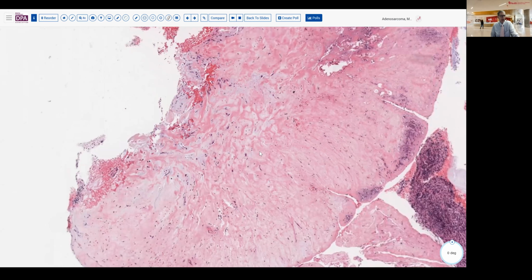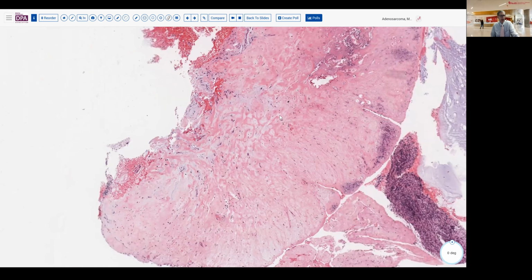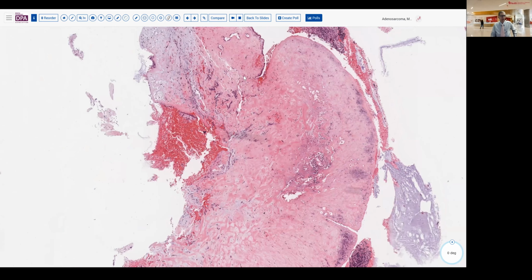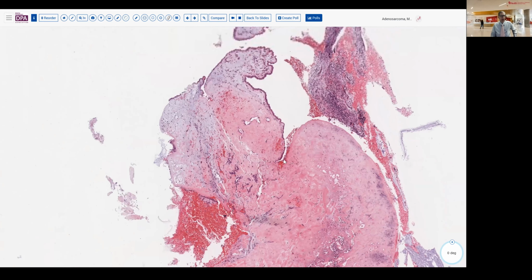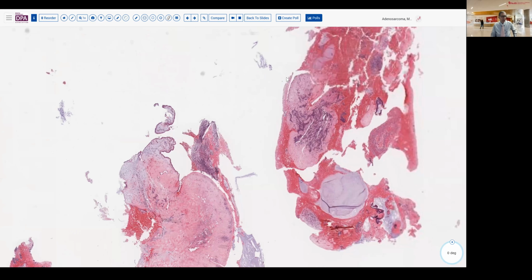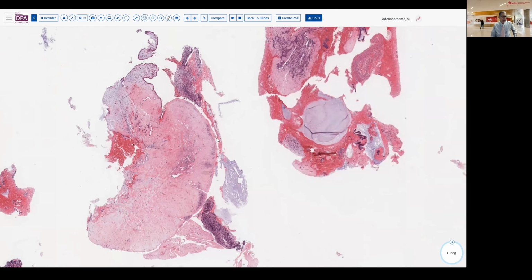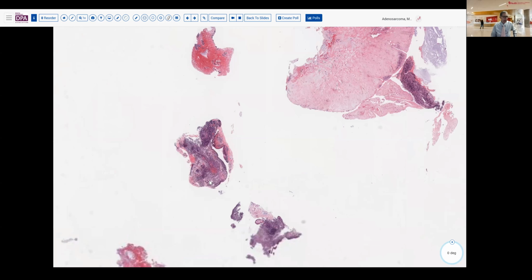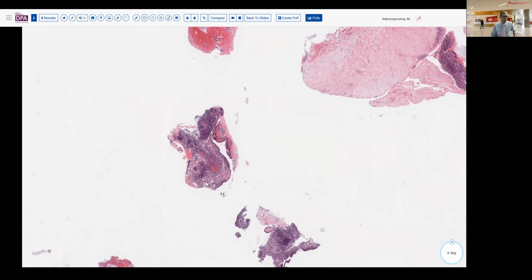So this is fairly characteristically seen in endometrial samplings, oftentimes following implantation. As we know, the placenta can induce a sort of hyaline scarring with a decidual reaction. And so with that presence of that kind of tissue fairly broadly in this sample, the reviewing pathologist made a diagnosis of a benign endometrium with probable placental site nodule, and plans were made for further therapy.